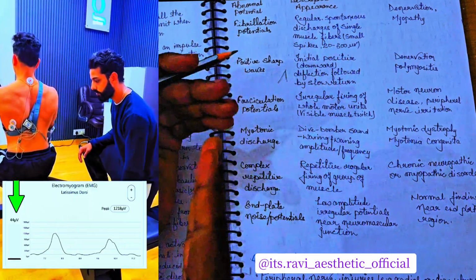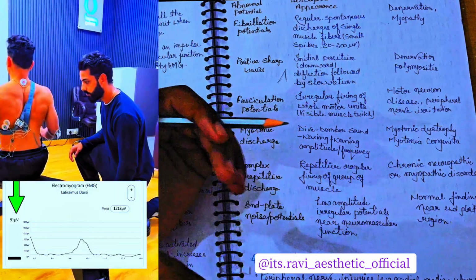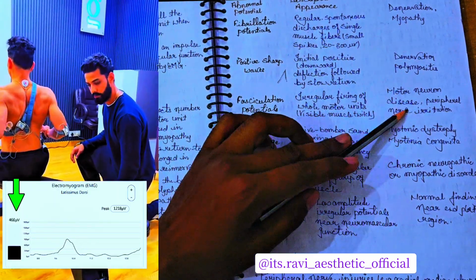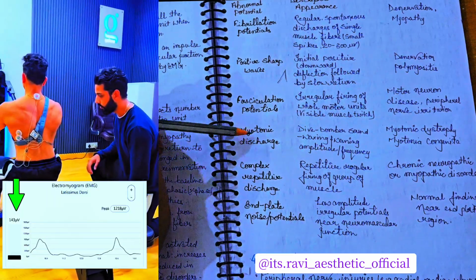It happens in UMN and LMN lesions. So it is a motor neuron and peripheral nerve disease, both of them occur. It is seen in motor neuron disease and peripheral nerve disease. So myotonic discharge, what is that?